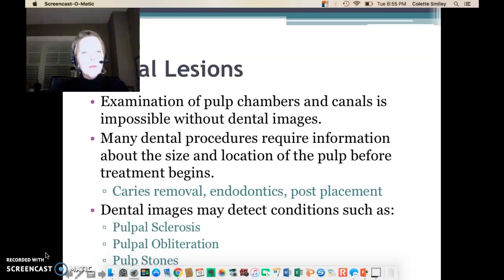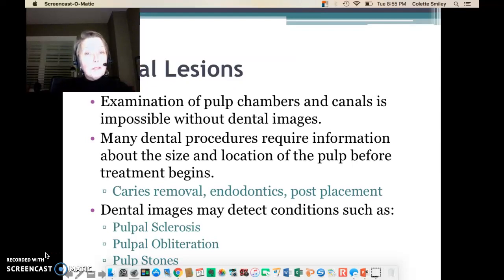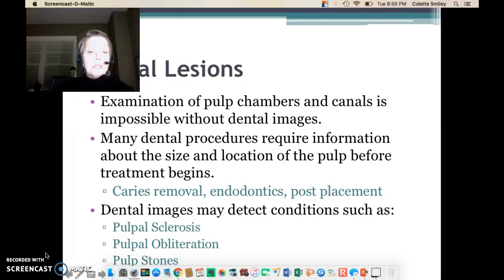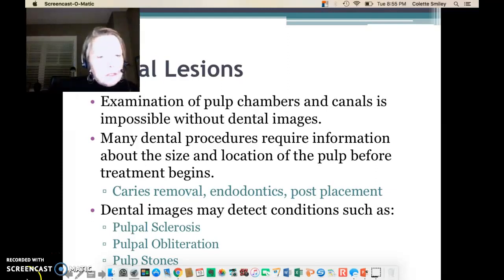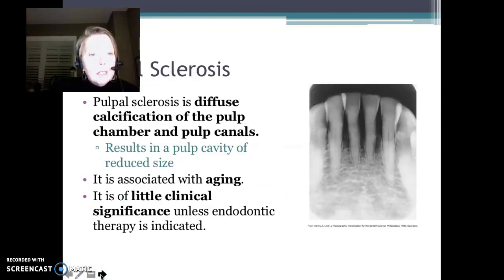Let's talk about the pulp and pulpal lesions. You cannot look at the pulp chamber or pulp canals without images, and there are many dental procedures I can't do without having images of the pulp: decay removal, endodontics, root canal treatment, post-placement. We're going to look at dental images and examine some pulpal conditions on those.